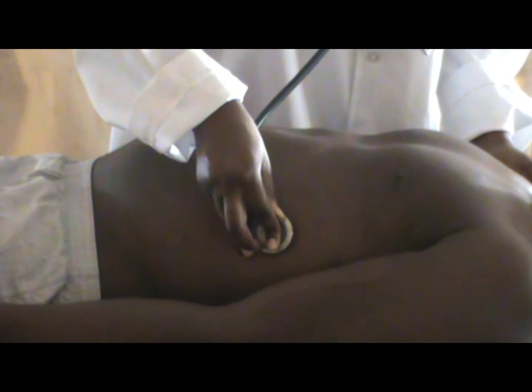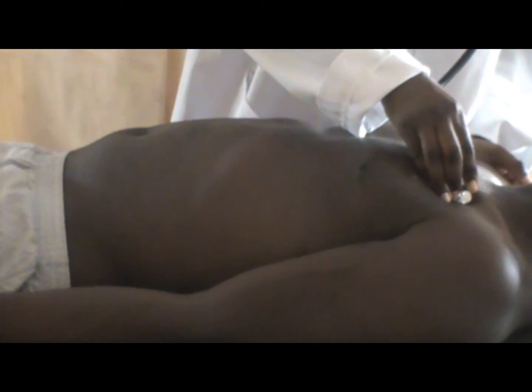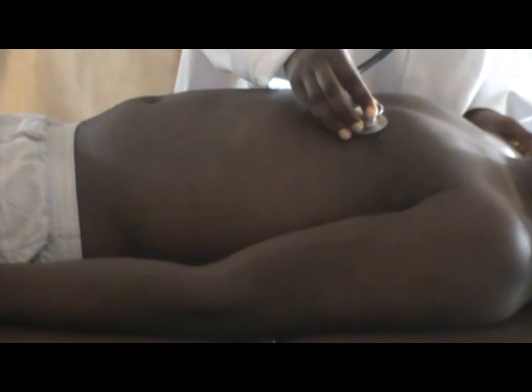Let us now watch Dr. Manuel examine the heart and listen to the sounds that emanate from the heart and the lungs. She starts with the anterior portion and then turns the patient around to the lateral side, both right lateral and left lateral.